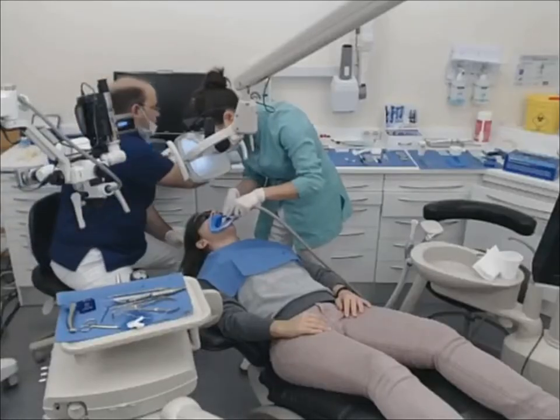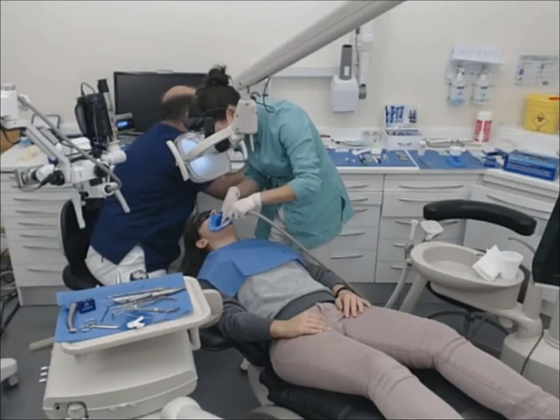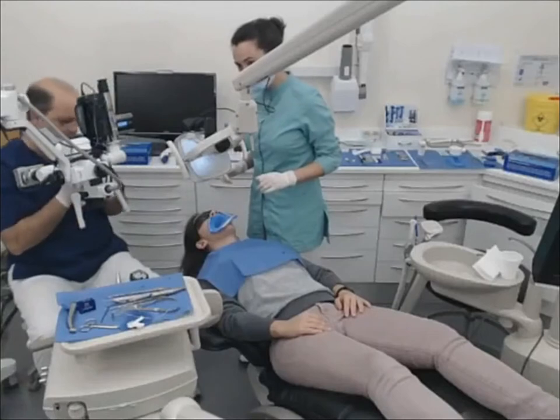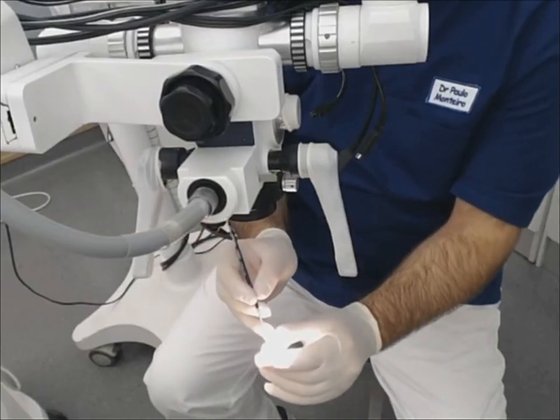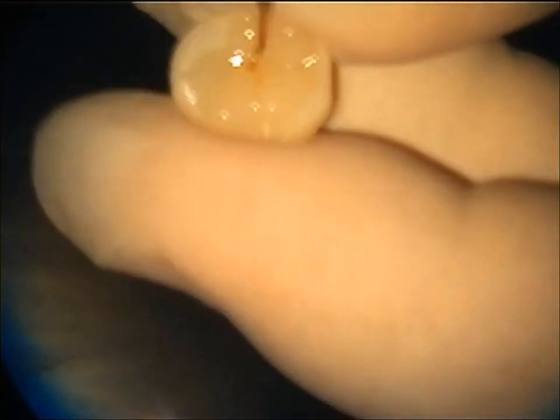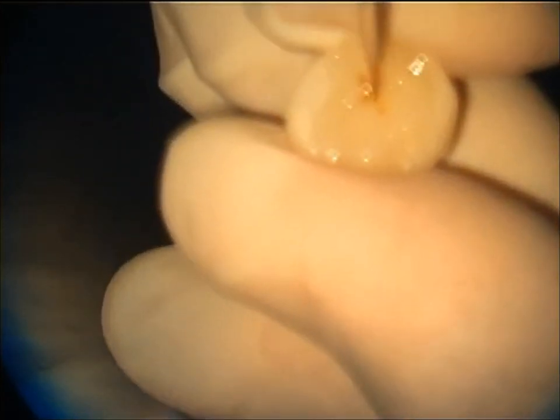Okay. So now with a brush, I just have here, this is brown tint. I use for this situation the paint, the Color Plus from Kerr. Okay, the brown from Kerr, the Color Plus. So with a brush, I just take a little bit on the brush, and then I'm gonna apply it, not too much.